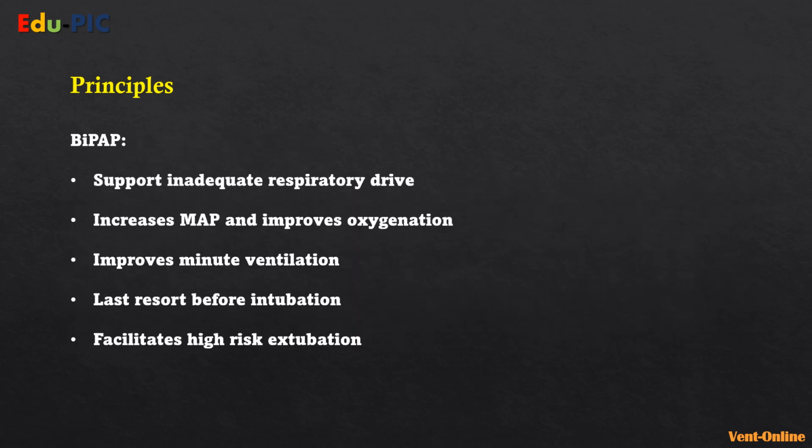So according to what we said, basically what we're expecting from BiPAP is to support inadequate respiratory drive. So if the patient is not really having a good respiratory rate or respiratory drive because they're a bit lethargic, or maybe a baby that has been extra premature and now is having apneas, then maybe that would help things going forward. Also, it increases the MAP, as I said, and improves oxygenation by adding a top pressure point. It improves minute ventilation by improving the tidal volume and the rate. And it's the last resort before intubation in some certain cases.